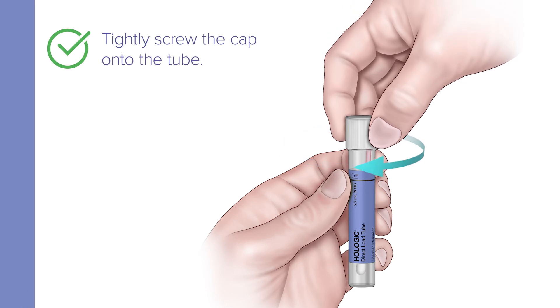Now, tightly screw the cap onto the tube and return it as instructed by your healthcare provider.